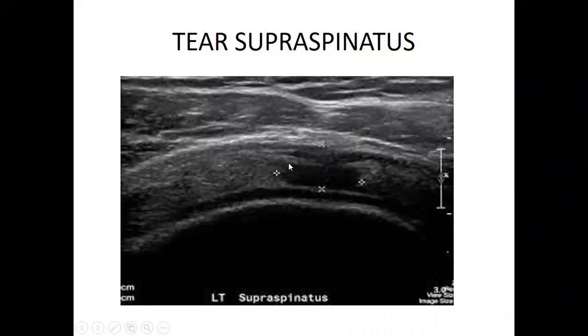Which maneuver do you pick this? You pick this within the anterior approach compartment where the patient extends their palm on the back. You are going to stretch this and you see the supraspinatus tendon. You can see there is a tear. That smoothness, that fibril, it's no longer there. So there is a tear here, you can see.